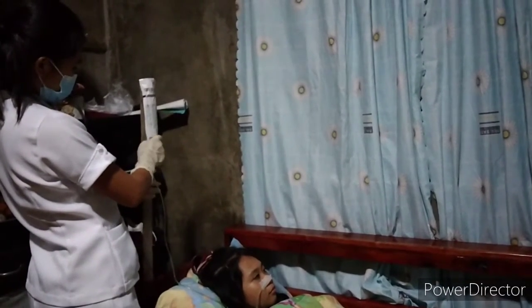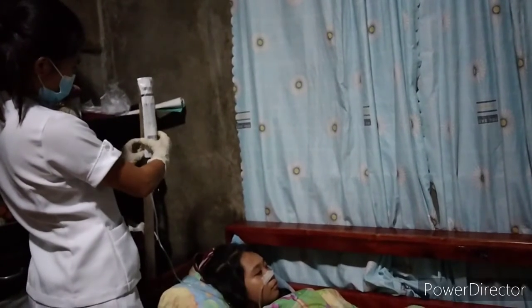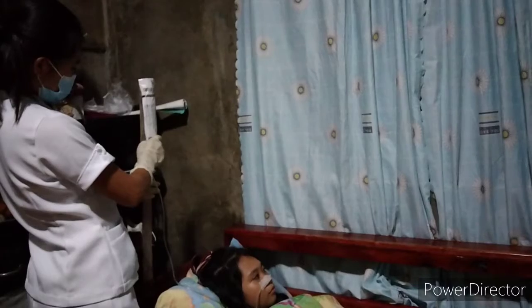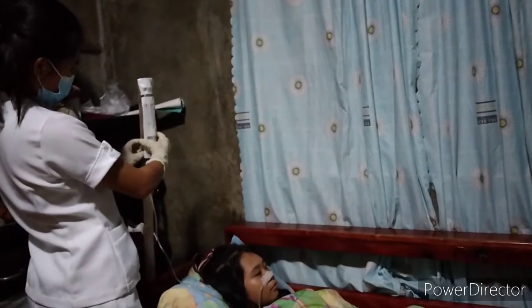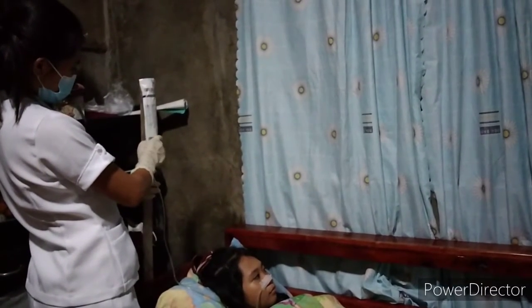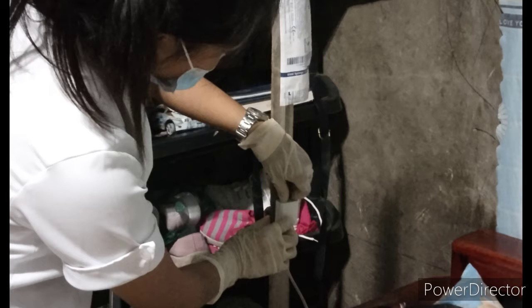Continuous drip method: hang feeding bag and tubing on IV pole. Continuous feeding method is designed to deliver the prescribed hourly rate of feeding. This method reduces risk of abdominal discomfort. Clients who receive continuous drip feeding should have residuals checked every 4 hours and tube placement verified. Connect distal end of tubing to the proximal end of the feeding tube. Connect tubing through infusion pump and set rate.